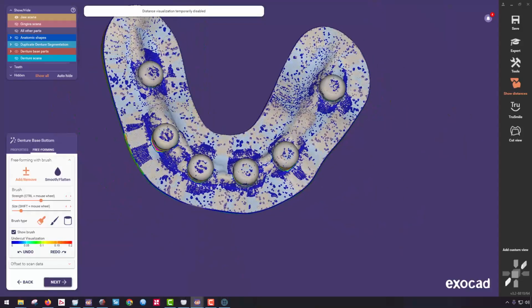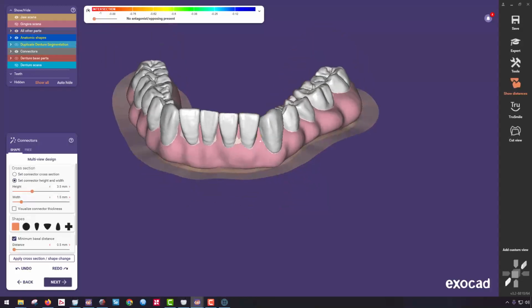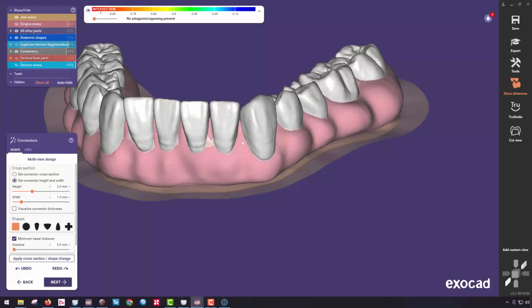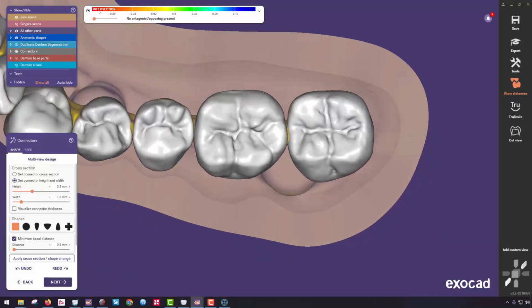Now I hit the next button. And now it's going to calculate connectors. Now, since I'm going to be making a printable arch, I do need connectors here, or else I'm going to be printing individual teeth. So I turn off my denture-based parts a little bit, turn off my denture duplicates, simplification, so I can see where my arch is.